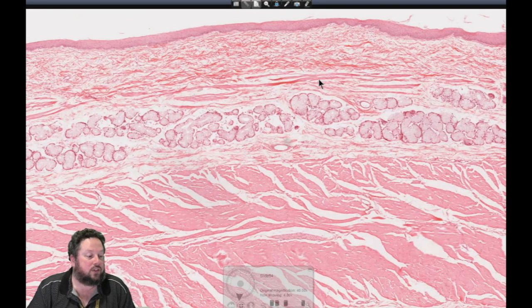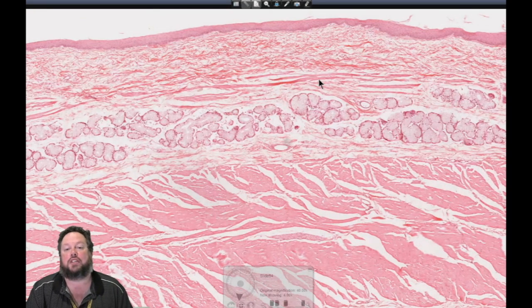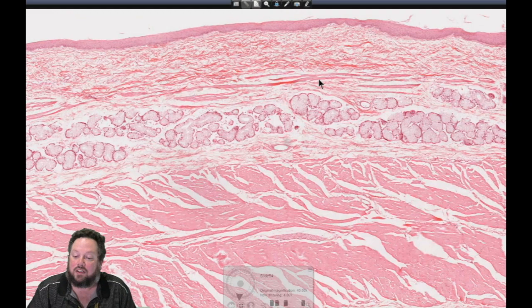So the middle third would not have submucosal glands. Yeah, we just saw that middle third. There were no submucosal glands present in that section. I did have an idea for a little research project just to confirm that, because it's kind of interesting that there wouldn't be any along the entire length, but unfortunately no one decided to do honours. So it's just a question for future reference.